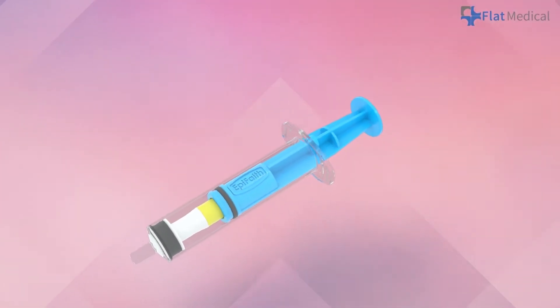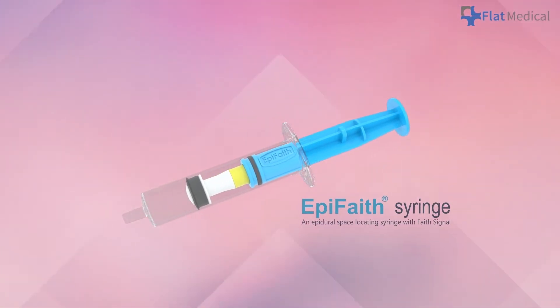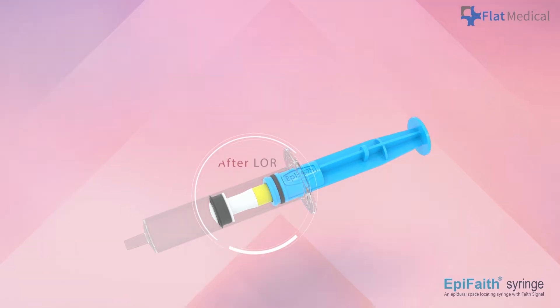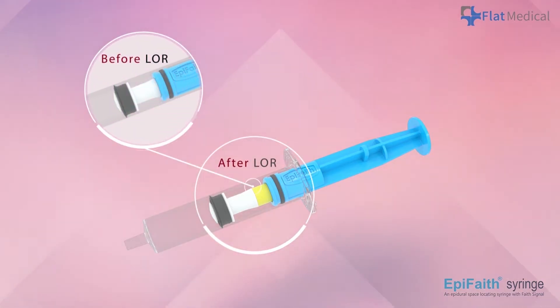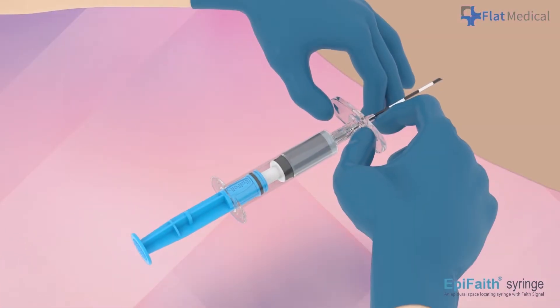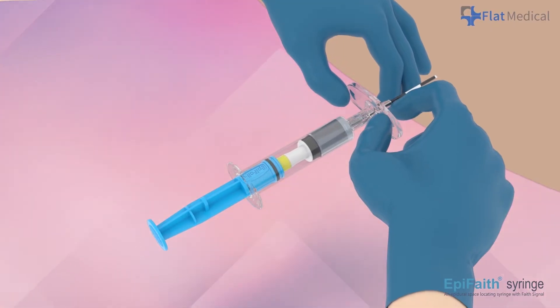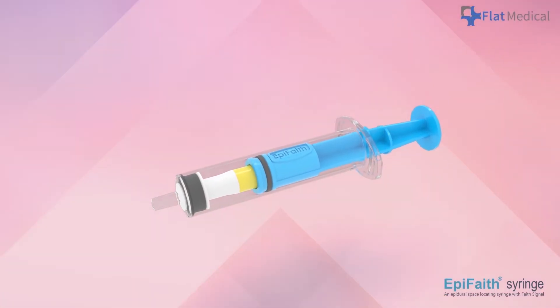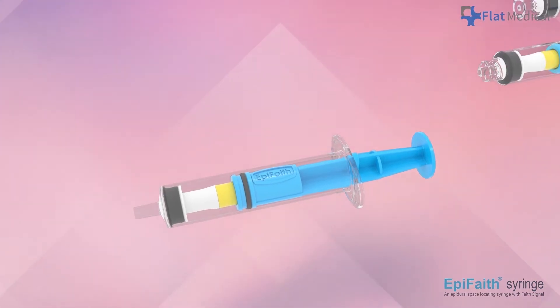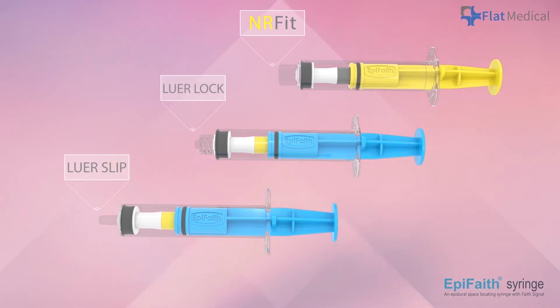The EpiFaith syringe is a compact and reliable tool designed for epidural localization. It features a unique automatic and continuous pressure detection mechanism that provides a clear visual signal to indicate the needle's position. Additionally, the device enables operators to use both hands to advance the needle for precise control. The EpiFaith syringe offers three connector options to accommodate various needle connector types. Please select one according to your preference and local regulations.